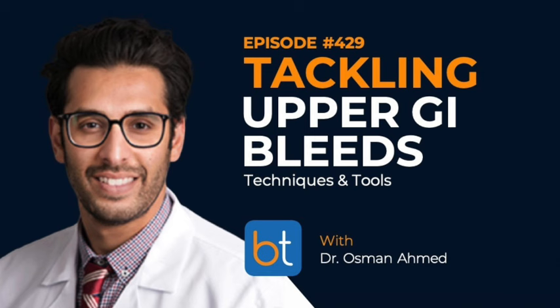And then also the radiopacity of it is less than most liquid embolics, so you have to get used to what its appearance is as well. Having it in a small vessel that has a long landing zone gives you a little bit of play to get used to it coming out of the microcatheter and seeing it. It looks a little bit like dilute contrast when it first starts coming out, and then as you progressively give a little more, it darkens. So again, you have to get used to that.